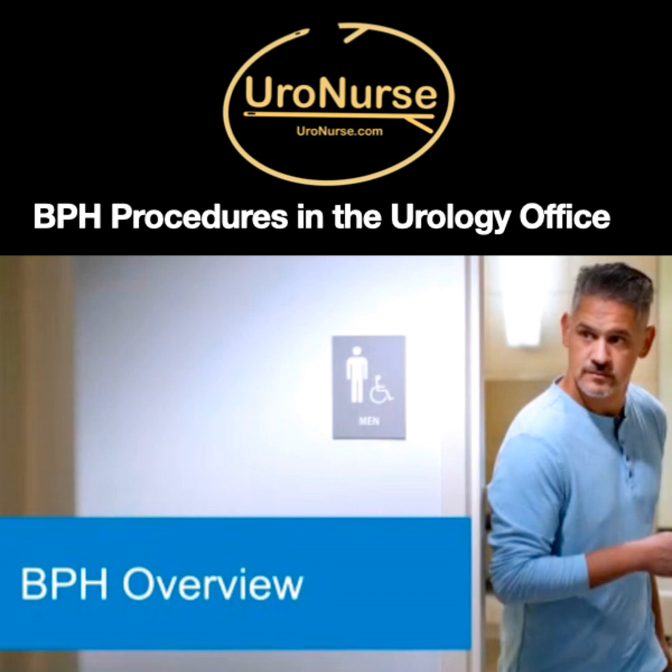At any rate, I don't want to go over this in too much further detail, other than saying that in terms of the anesthesia, I do it the same way. They get a good prostate block. They get a 4-point prostate block at both the base and the apex, and then nitrous in the office setting, and the patients handle it quite well.